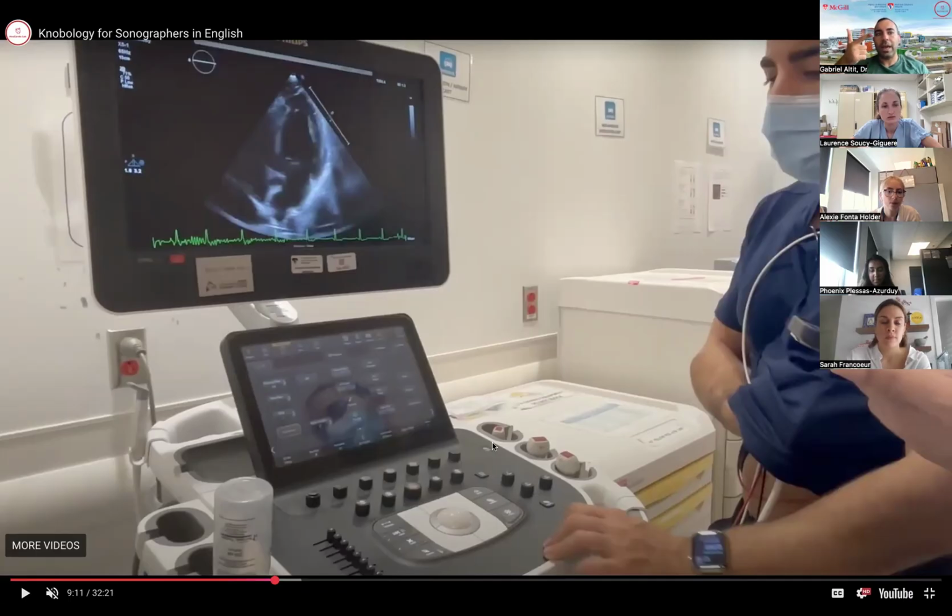So sector width and depth. The more you adjust it, the more you improve what we call the temporal resolution. Temporal means time. So you're able to obtain much more frames per second if you have a much more narrowed image. These buttons will correspond to the selection on the screen here.